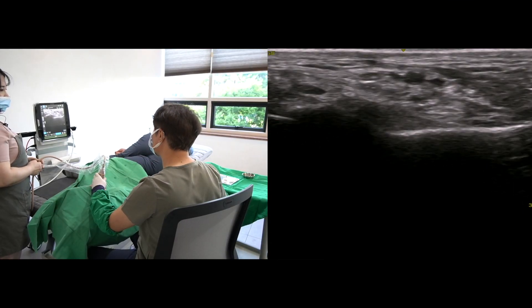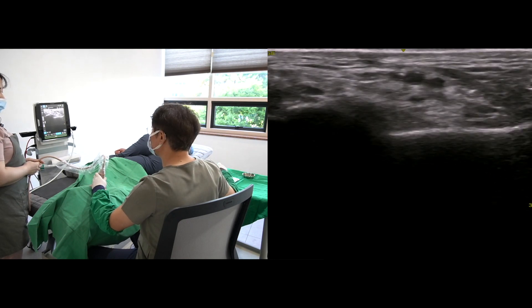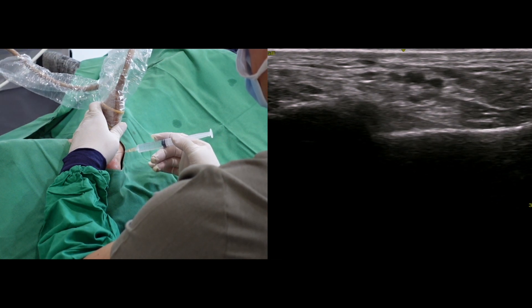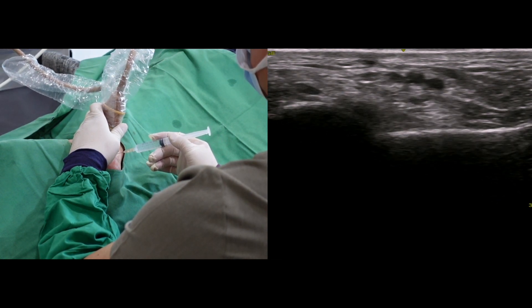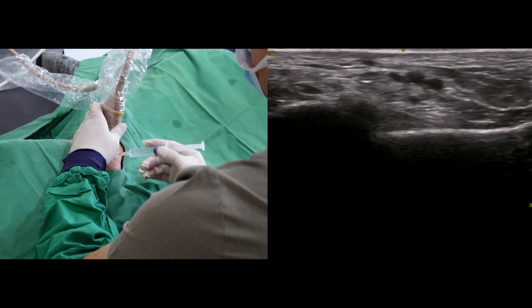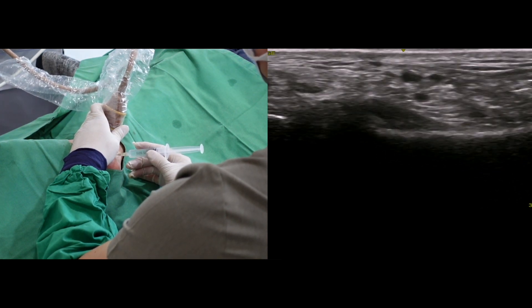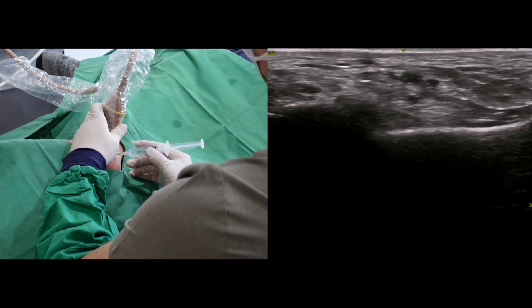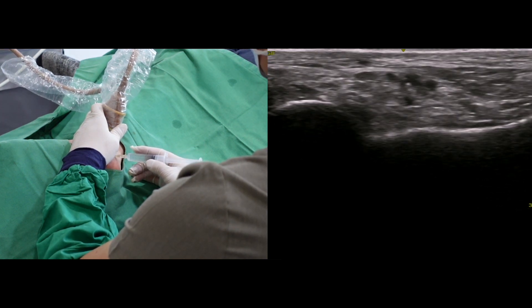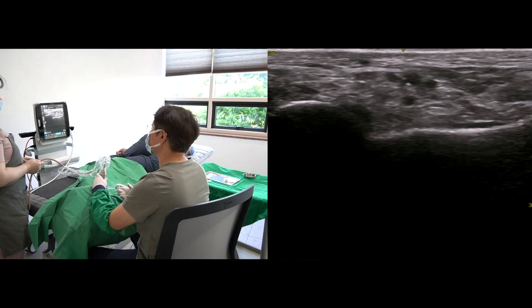Veins are easily compressible under pressure. I will insert the needle from posterior to anterior direction under ultrasound guidance. The needle echo will not be eye-catching because it is small caliber and disturbs soft tissue echo texture. I have to focus my attention to find the needle tip. If I notice the needle tip penetrating the medial septum, it is almost there.